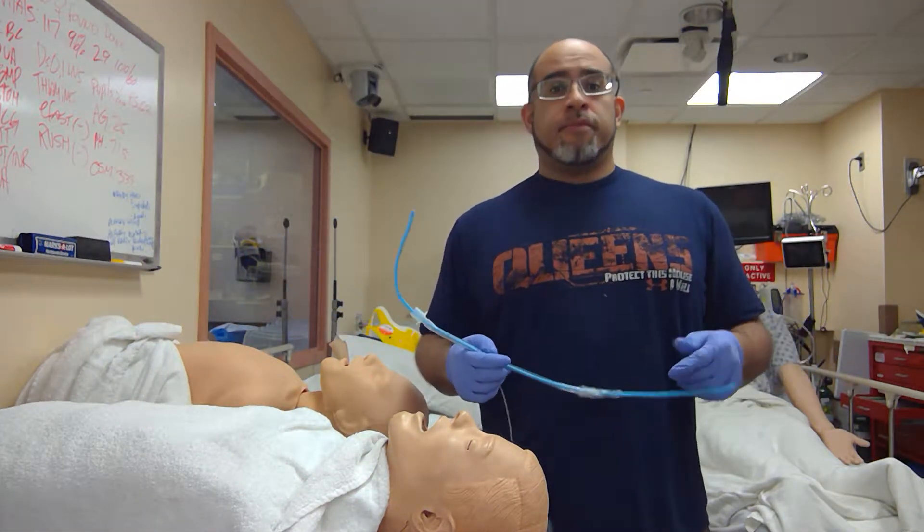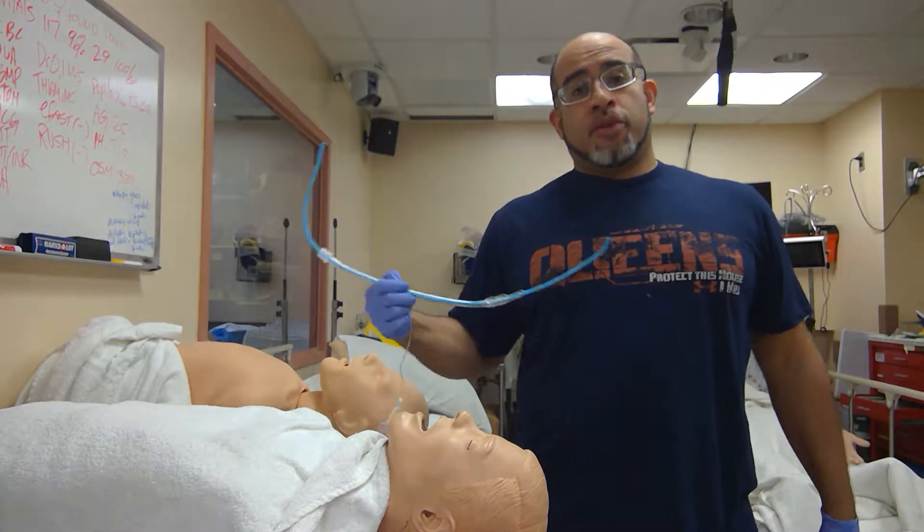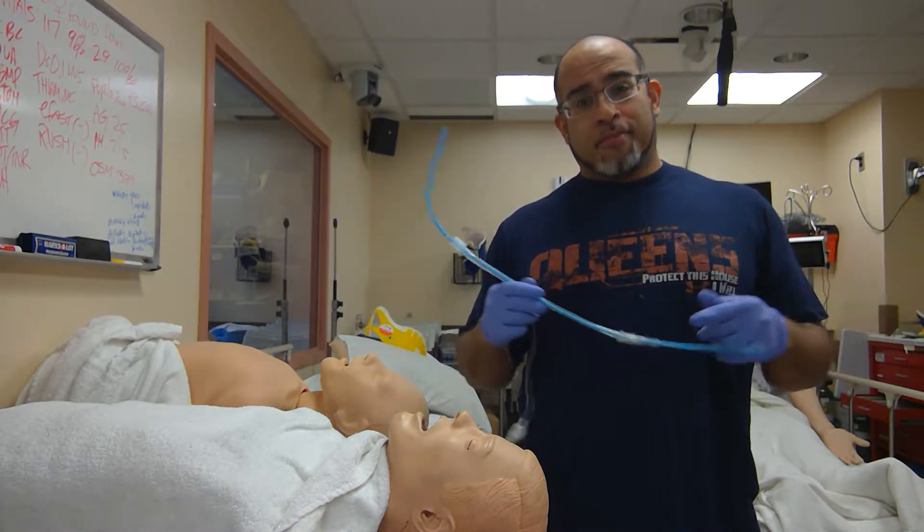Welcome back to another episode of School of Airway with Dr. Torres in the lab. I'm Norma. Protect this house. Protect this airway.